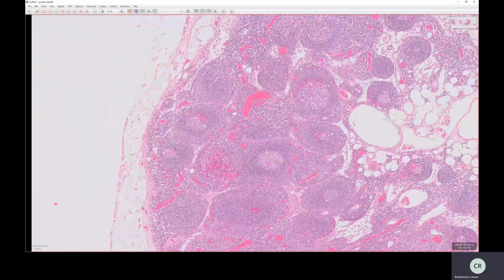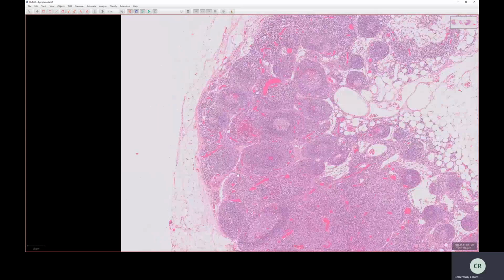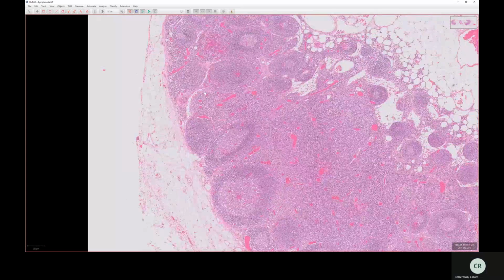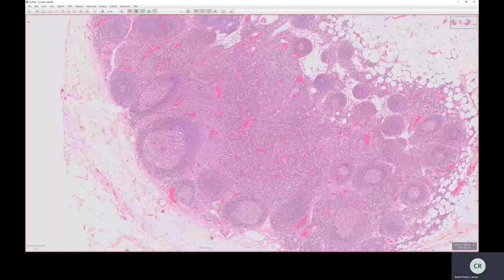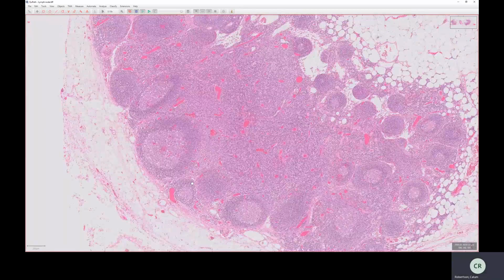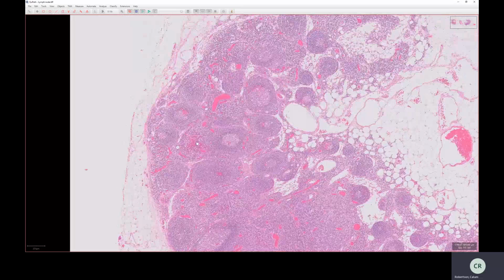And so if a lymphoid follicle has a germinal center, it's a secondary follicle. And if it doesn't have one, it's a primary follicle. So the cortex of the lymph node is the domain of B lymphocytes. So the cortex, essentially, is made of B lymphocytes, whereas the sinus is just macrophages or histiocytes.